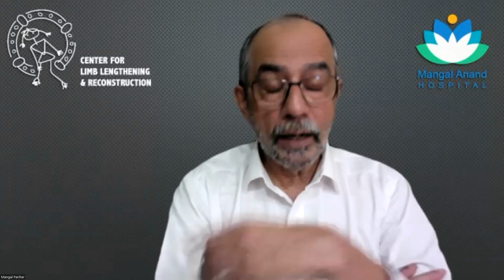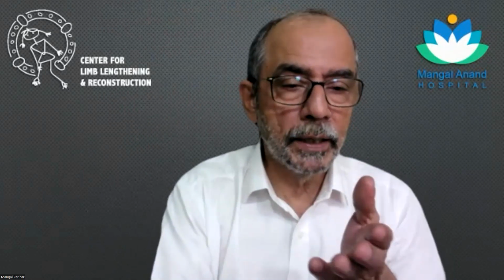Second thing is, mostly my osteotomies will be below the tuberosity. So these patellofemoral issues should not occur. I have not noticed anything when I do it with fixators, but that's because the osteotomy is distal to the tuberosity.